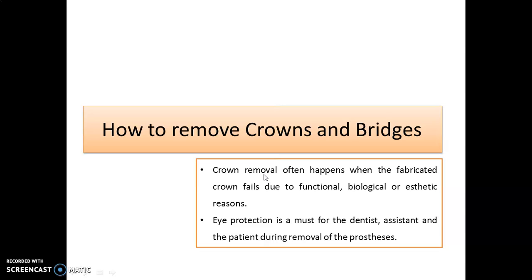And this topic will also be helpful for day-to-day clinical practice, because most often we come to cases where we need to remove crown and bridges. The reason can be functional, biological and aesthetic. The most important care we have to take during crown and bridge removal is the eye protection of the patient, dentist and the assistant. There have been reported cases where the dentist, assistant or patient have injured their cornea of the eye because of the fragment removed from the crown.